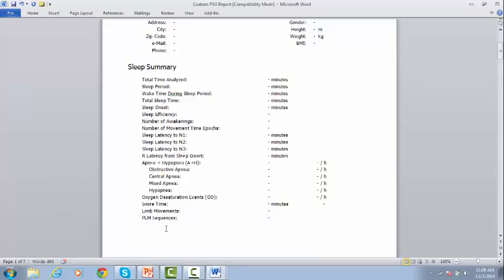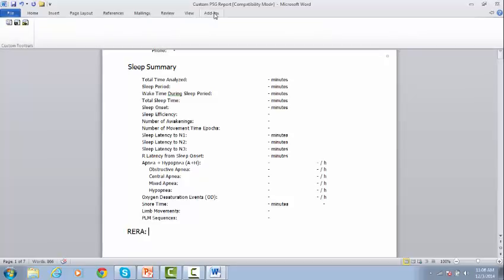If you want, for example, to report RERA counts, then type the reference text, go to Add-ins, and from the Custom Toolbars select the first option.